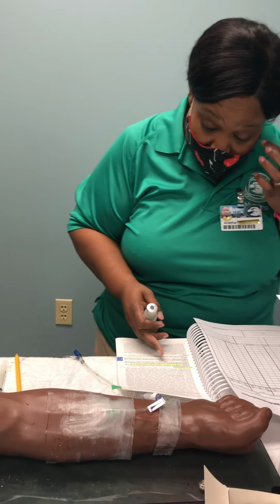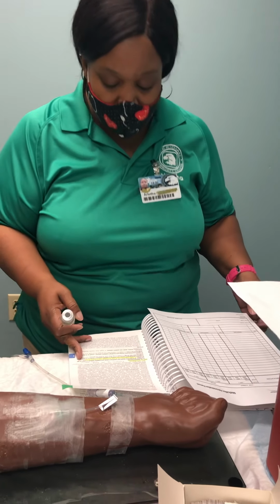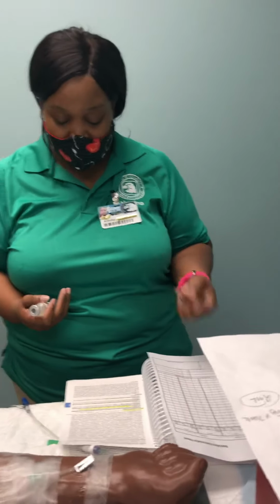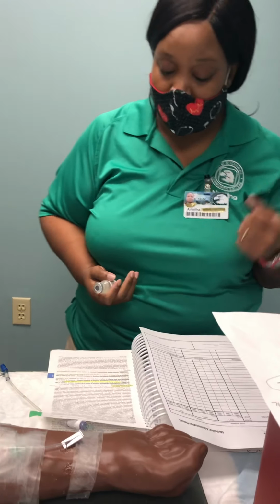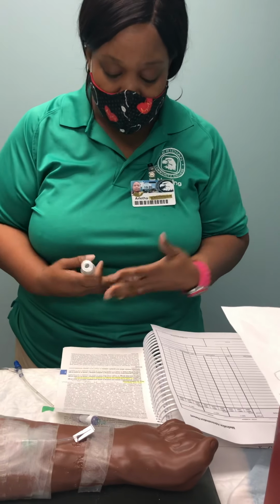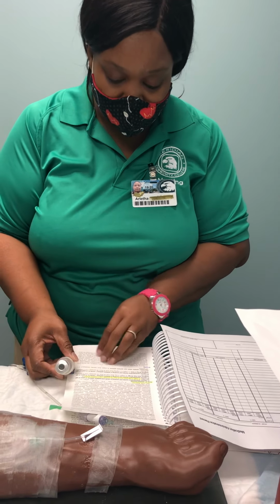This medication, I'm checking the dose. It says a single 4 milligram dose over at least 30 seconds, 2 to 5 minutes is preferred. So I'm going to give 2 milliliters over 5 minutes. So I'm going to give 1 milliliter over 2.5 minutes, and I'm going to give the other milliliter at 2.5 minutes. The total ought to be 5 minutes.